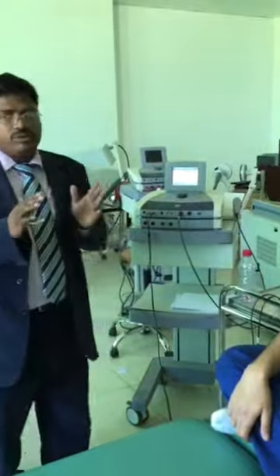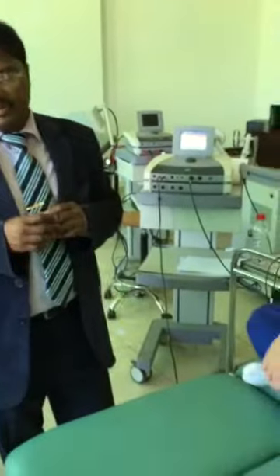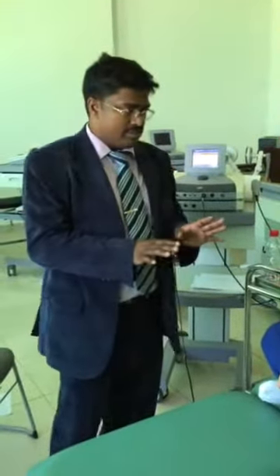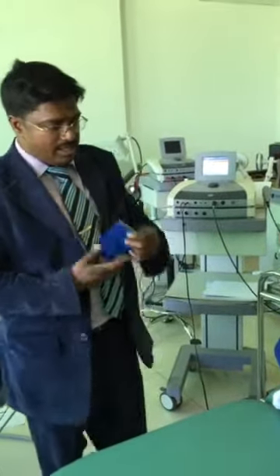When you want to apply the TENS onto the patient's body, there are several methods of application. One is pain point application — wherever the pain is, you keep the electrode on that, whether it is positive or negative.